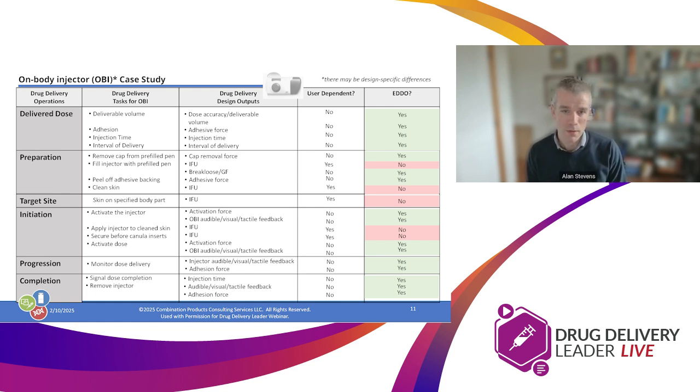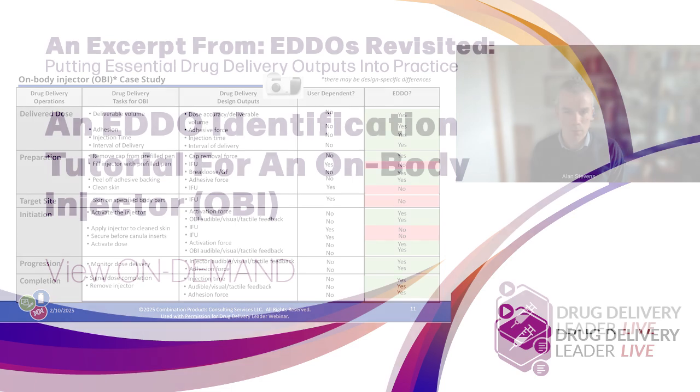And associated with that, there's forces to activate buttons, there's feedback mechanisms, there's instructions for use, to make sure that you do things in the right order, at the right time, and apply in the right location. And then based on that, some of these are design elements, and some of them are user requirements.